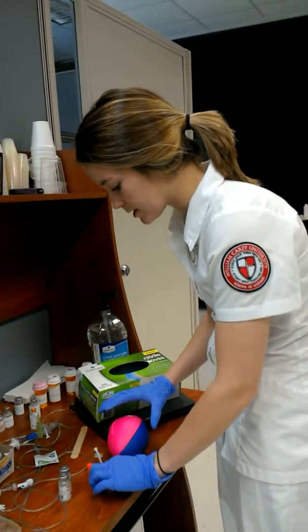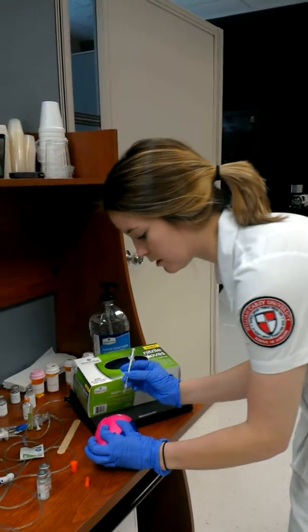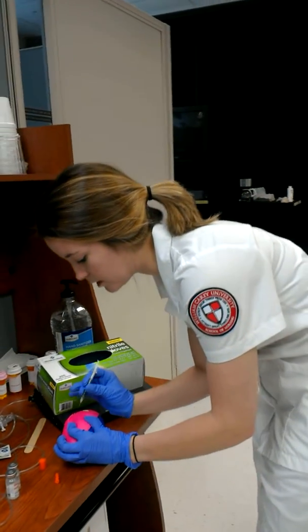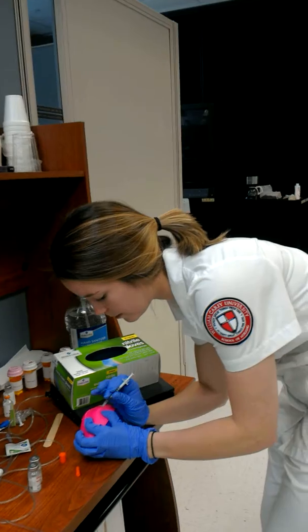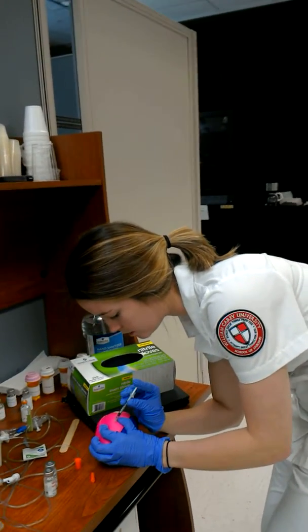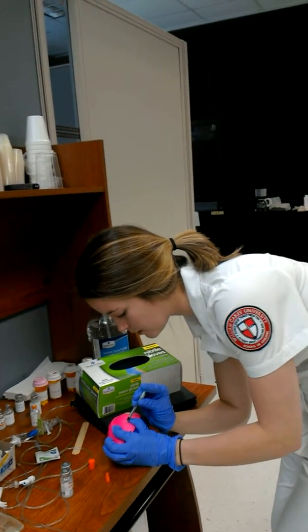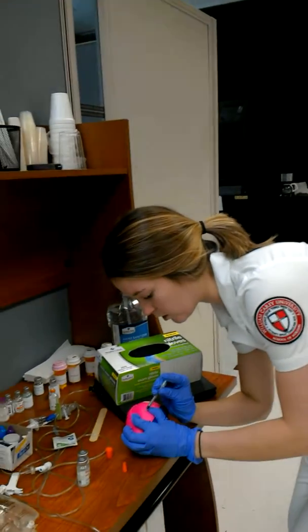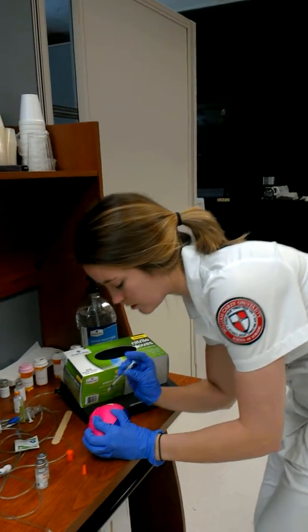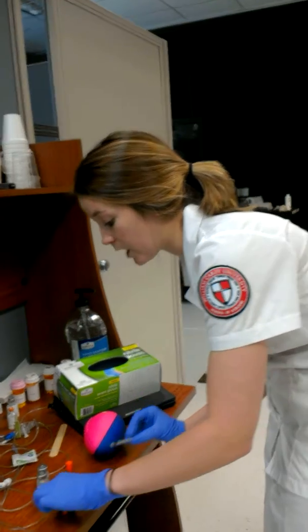So I'm going to take my insulin, I'm going to pinch the skin up, bevel up, and it's going to be like a dart at about 45-degree angle. So dart it in, and then just kind of slowly insert the insulin, and then I'm going to hold it for a second just to make sure that it all goes in, and then take it out. I'm not going to massage the area or anything.